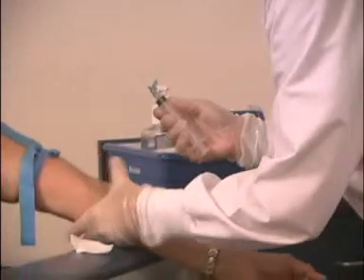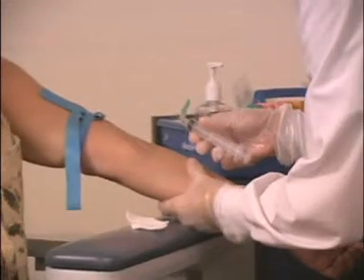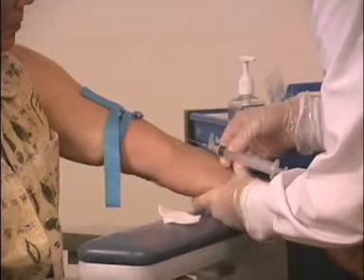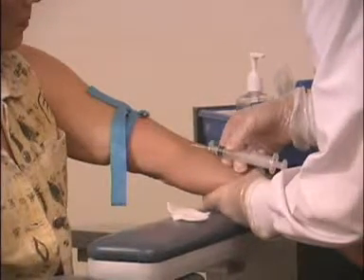Anchoring stretches the skin so the needle enters easily and with less pain, and keeps the vein from rolling. Anchor by grasping the arm just below the elbow, supporting the back of it with your fingers. Place your thumb one to two inches below and slightly beside the vein and pull the skin toward the wrist.